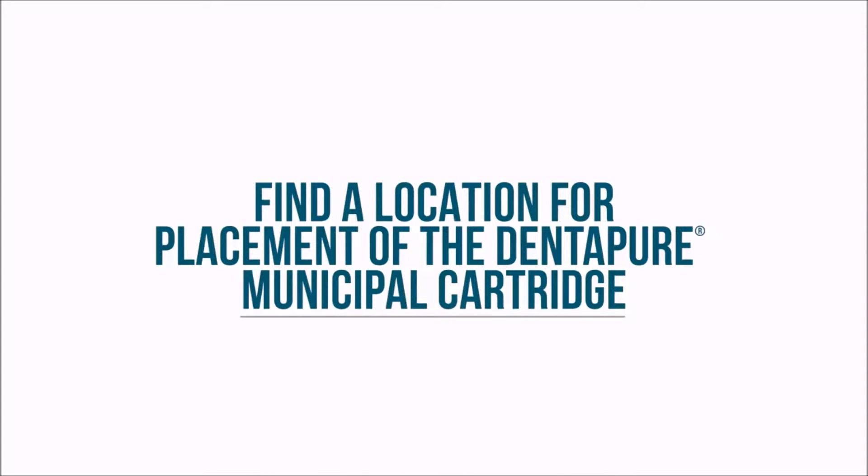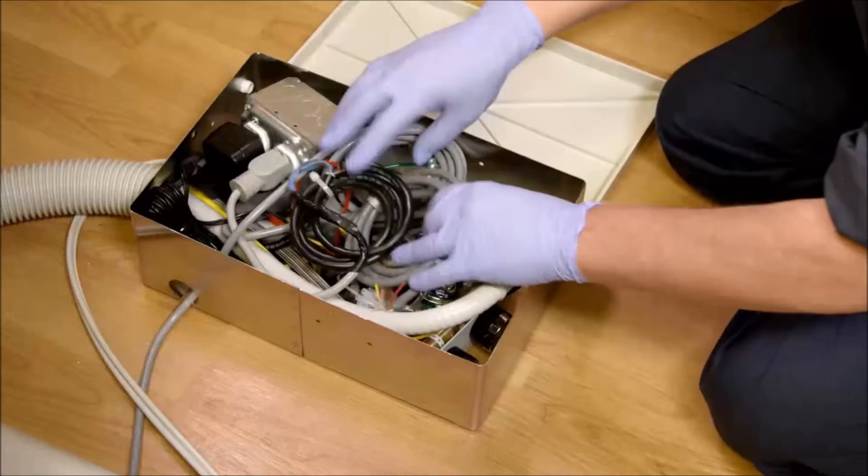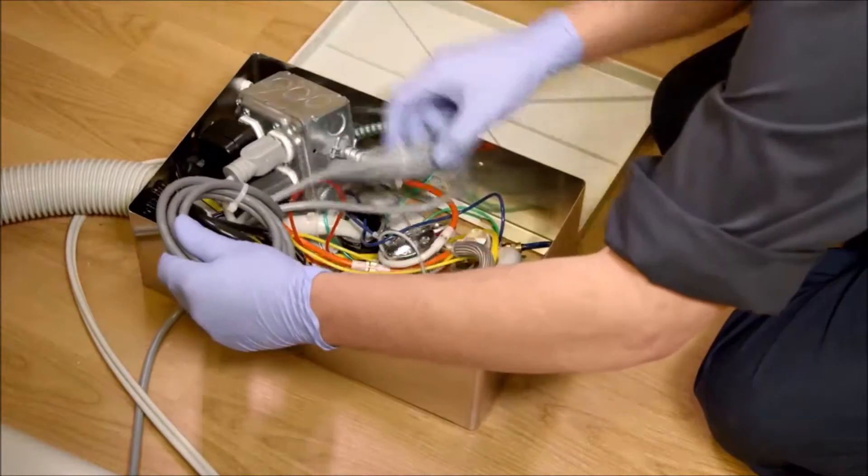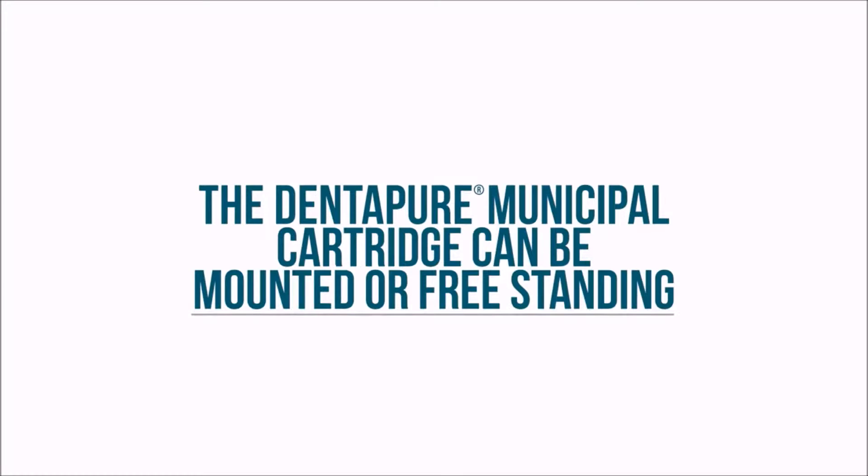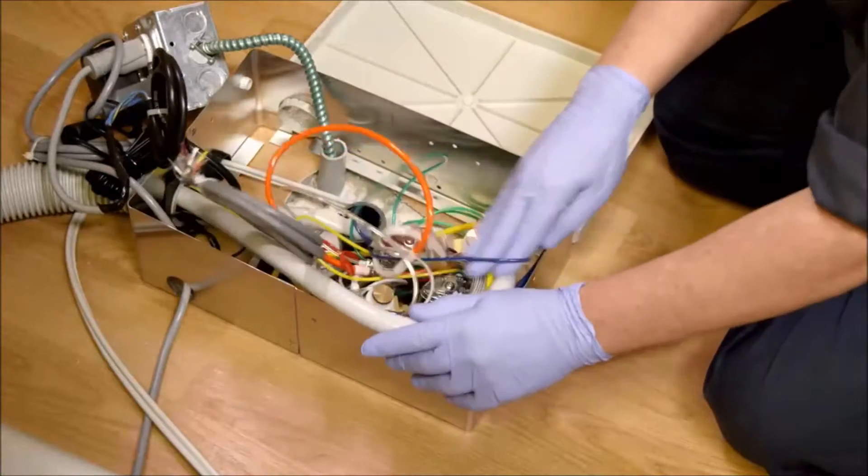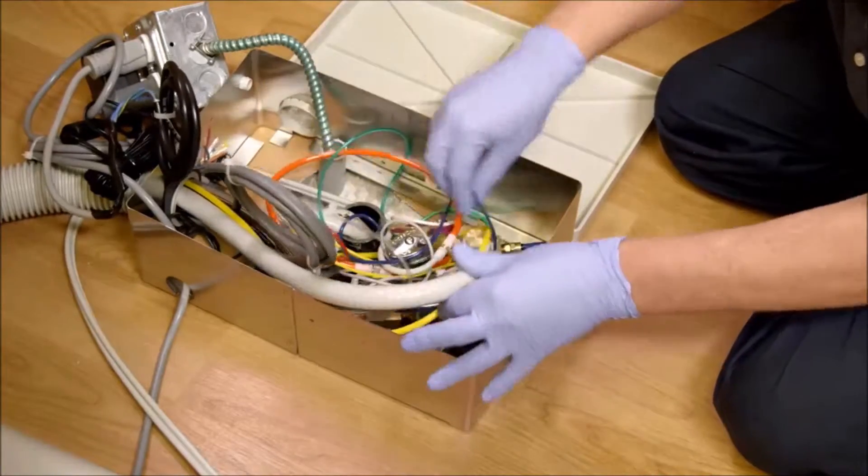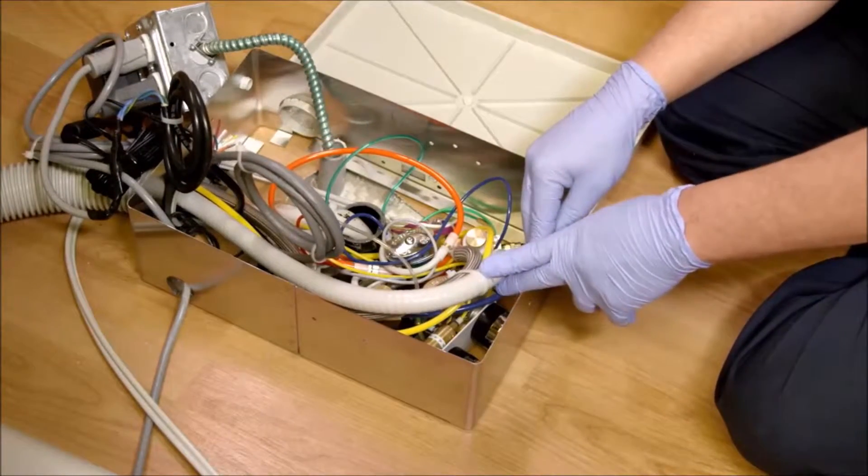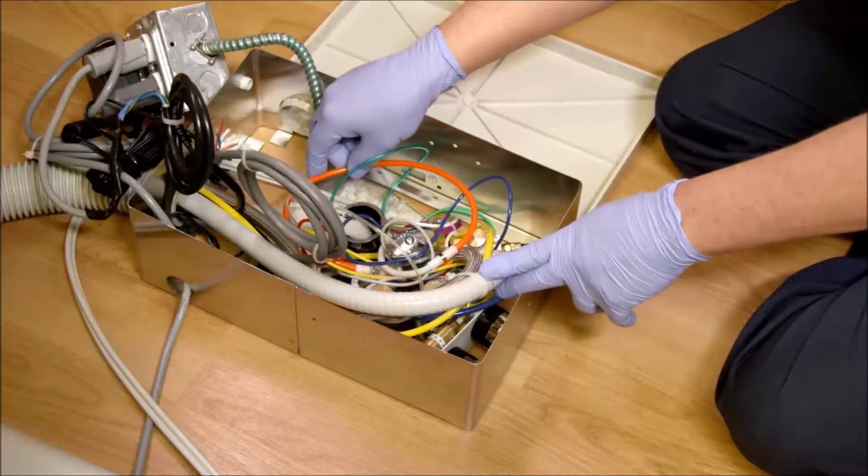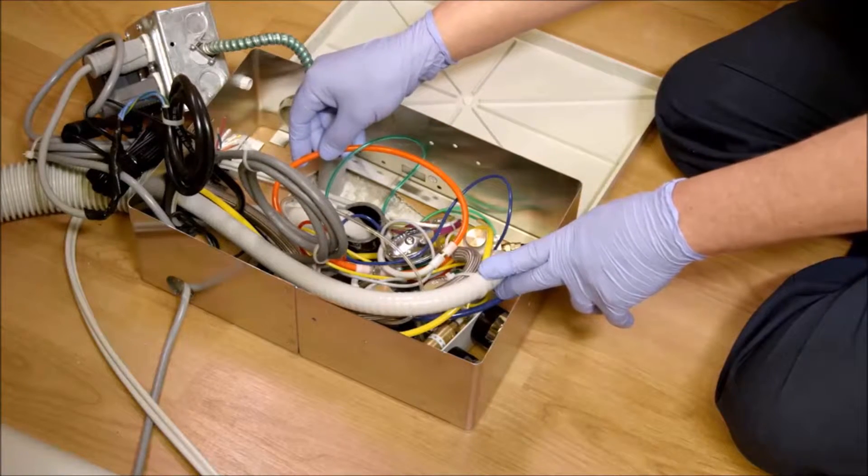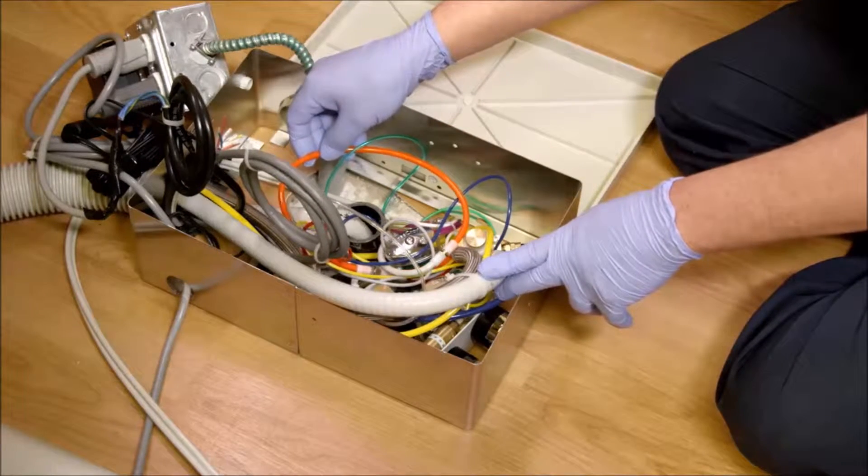Next, find a suitable location for placement of the Municipal Cartridge. Keep in mind that the cartridge could be mounted or free standing inside the junction box. This location should be able to fit the cartridge while avoiding putting pressure on other tubing, pipes or fittings. Placement should also avoid causing kinks in the tubing and be near the water regulator.